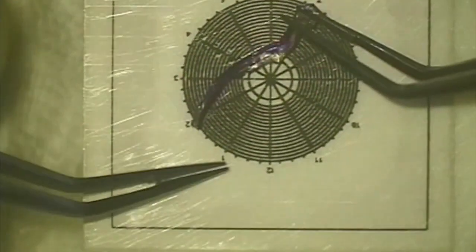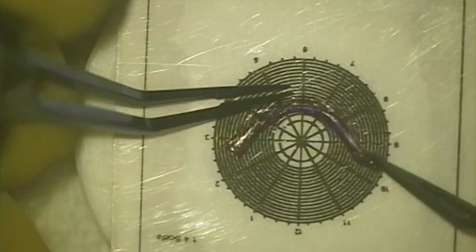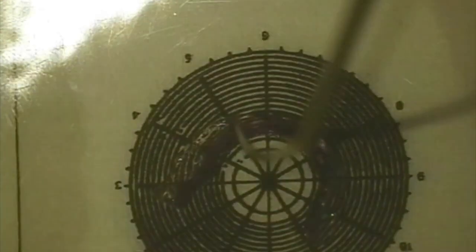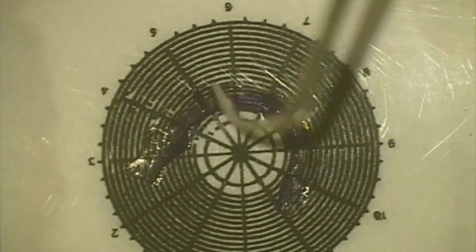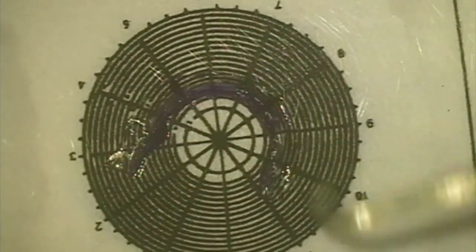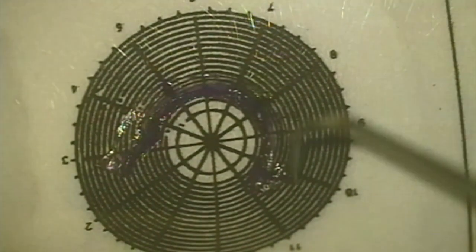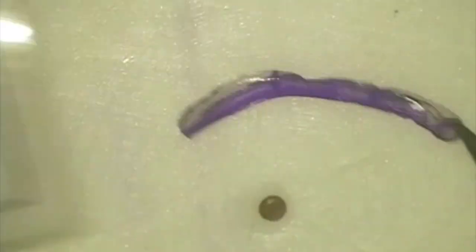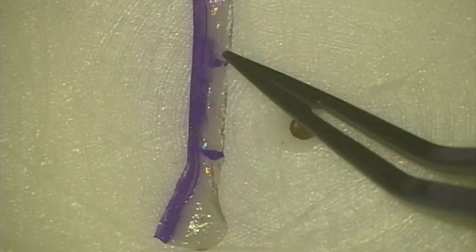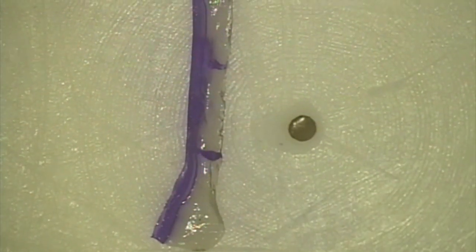I have taken the desired length of segment. This is a special degree zone marker that I have designed, which is also soon going to be available in a titanium model — I do not have any financial interest in it. This degree zone marker helps me accurately mark on the CARES segment the length of segment that needs to be implanted into the patient's eye. I put three marks on it, one of which will be for creating a taper.